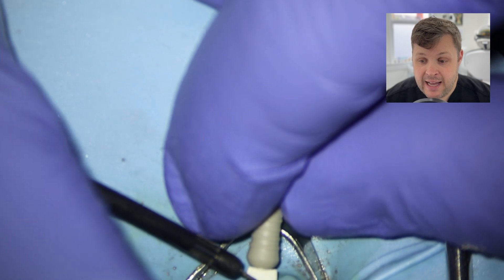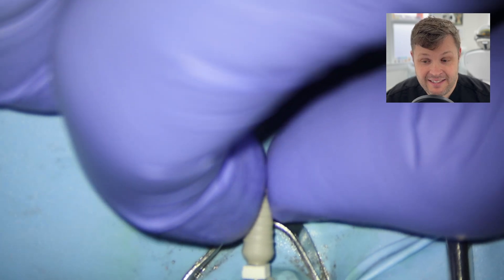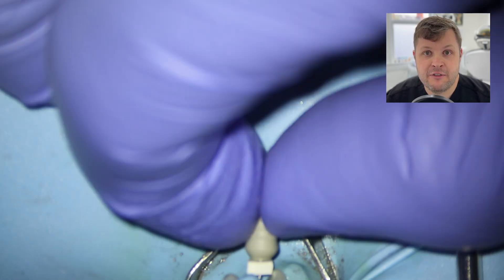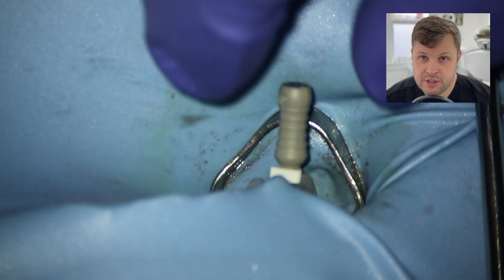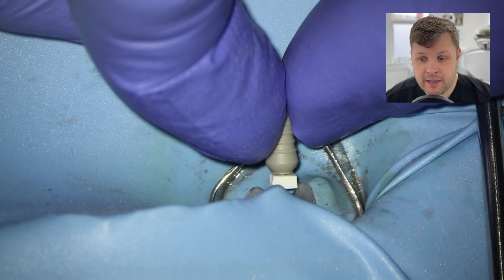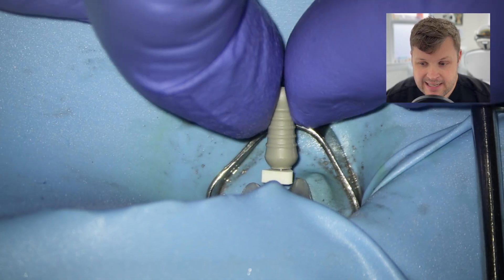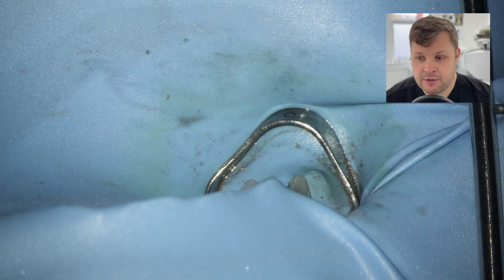Now I want to keep the hand file at length and gently shape the final millimeter of the apex. I'm not going to pull it out because sometimes if you pull it out you can't get back in again. You'll notice I am going past zero — you have to be super careful not to destroy the apex, but with a size 8 there's no real risk of that. I'm just gently shaping out the apex.